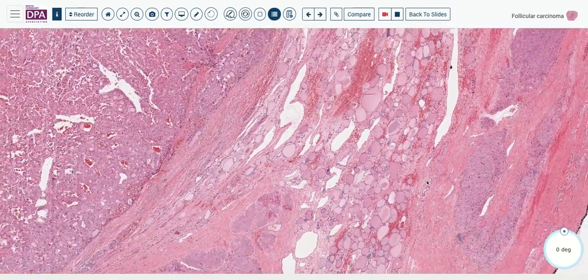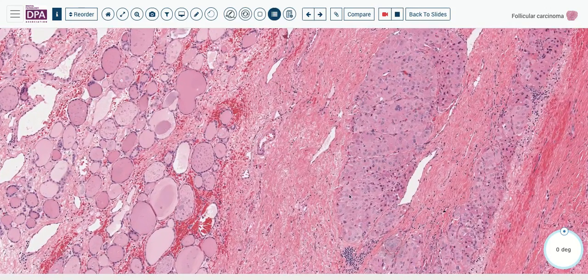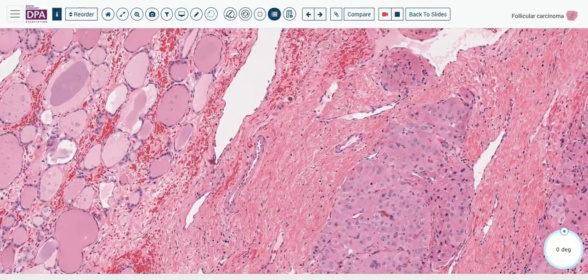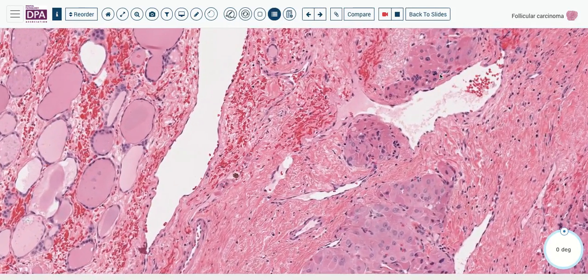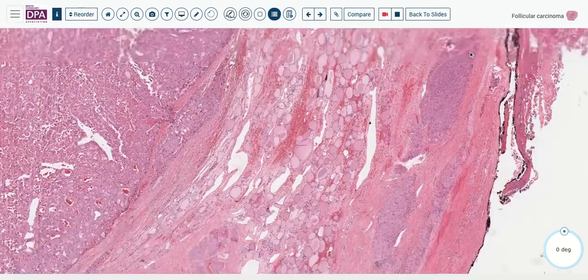Here we see out here, this is tumor, this is a vessel, this is tumor overlying with endothelial overlying it, this is vascular invasion. Similarly, we could account for this feature here, just barely covered by endothelium, maybe vascular invasion out here as well.